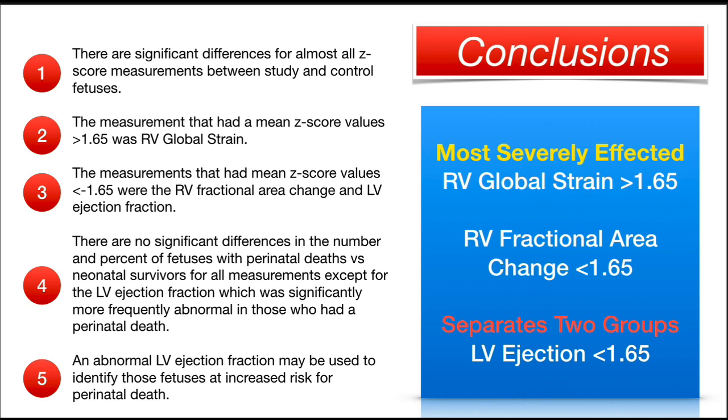An abnormal LV ejection fraction may be used to identify those fetuses at increased risk for perinatal death.